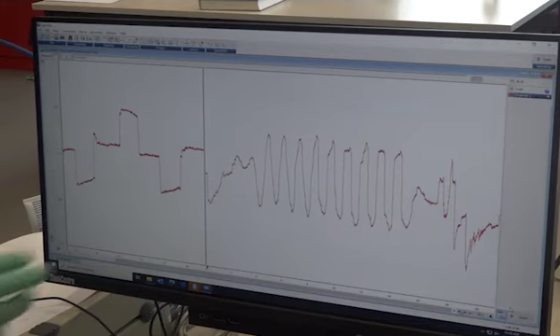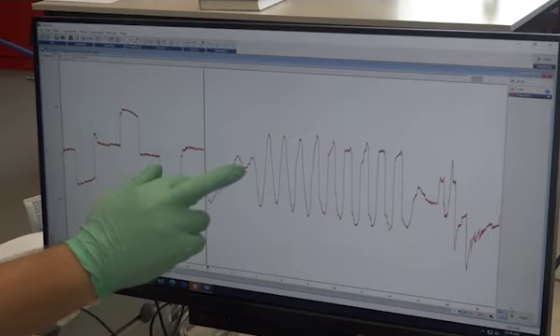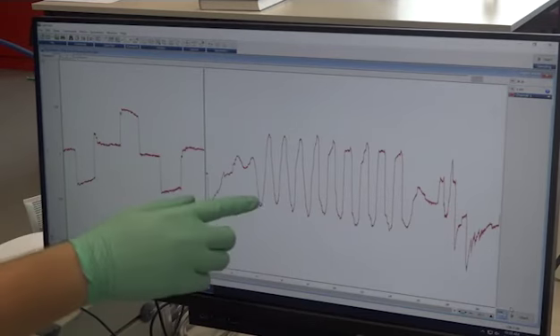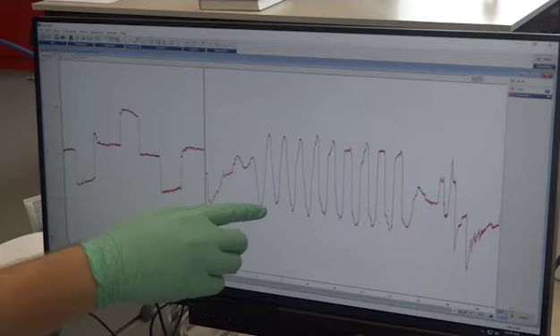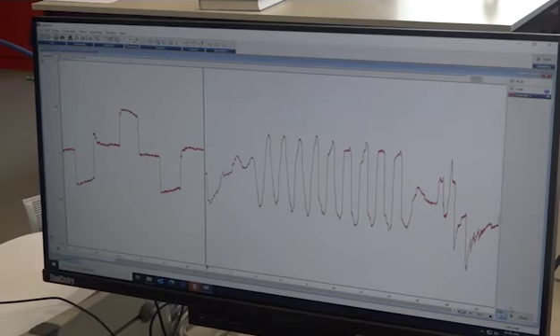And as we swing upwards and go positive, that's when we're shifting our gaze back towards the left, where the positive electrode is. Now, with smooth pursuit, this is the type of movement you get, that nice rhythmic back and forth. You can tell that the eye movements are not as abrupt, so not as steep a vertical change as with a normal saccade. Instead, we have more of a nice rhythmic sinusoid type rhythm.